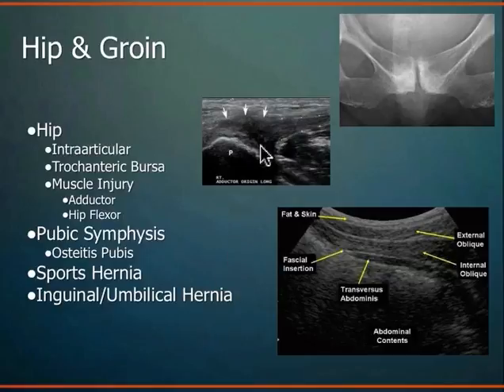So here's an adductor muscle tear and the associated adductor tendon. You see this collection of hematoma, tissue disruption, and retraction of tissue in the area of the tear. The groin and the hip is an area where MRI is traditionally less reliable, and it's very hard to image some of these subtle muscle weaknesses or muscle fascial herniations.